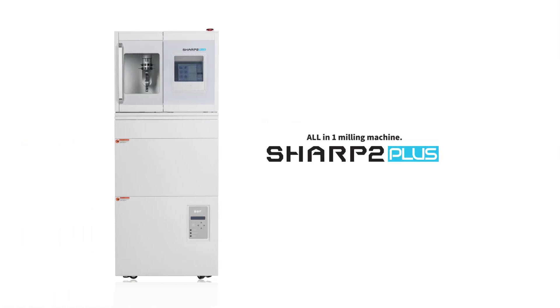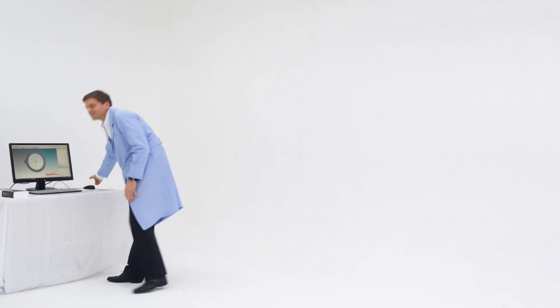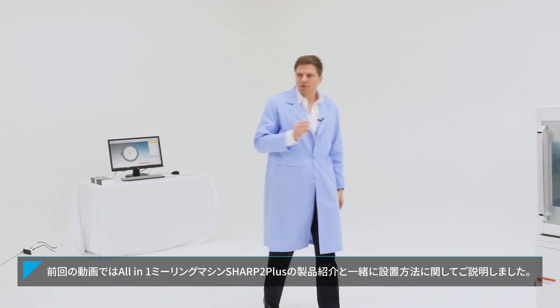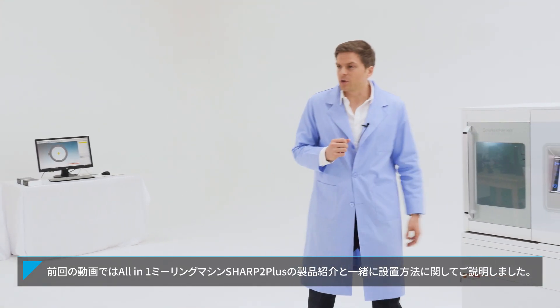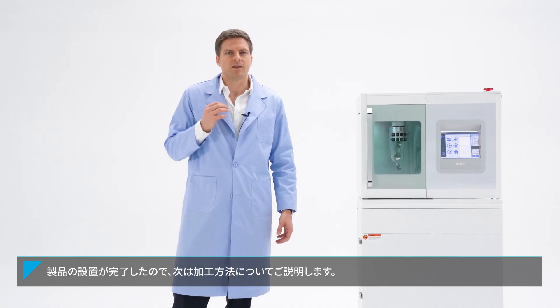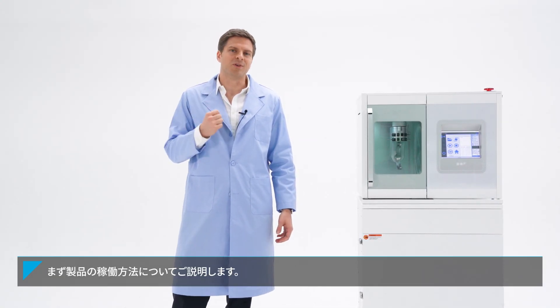DOF. Did you assemble it properly? In the previous section, I introduced the all-in-one milling machine Sharp 2 Plus and how to assemble it. Now, let's learn how to mill with it.